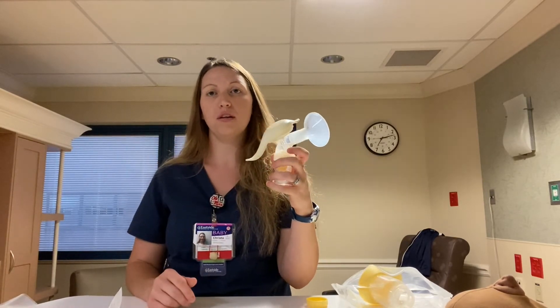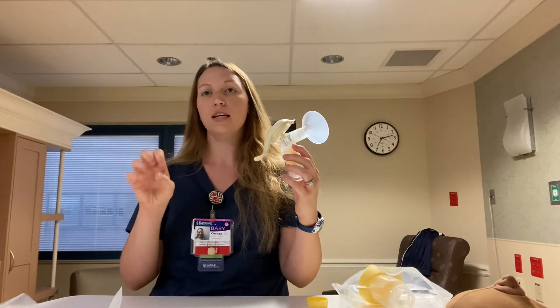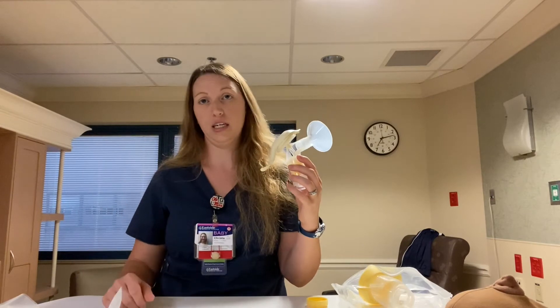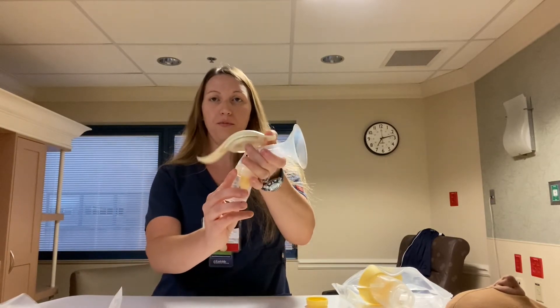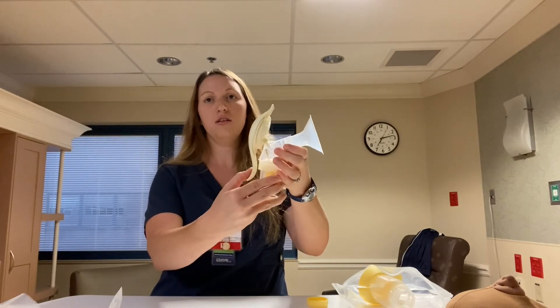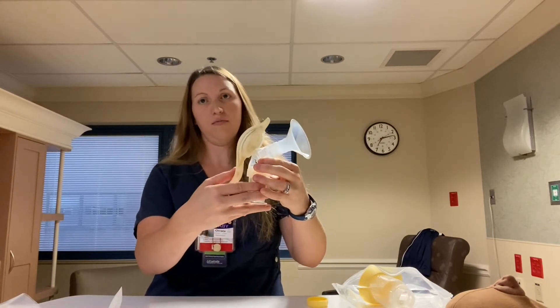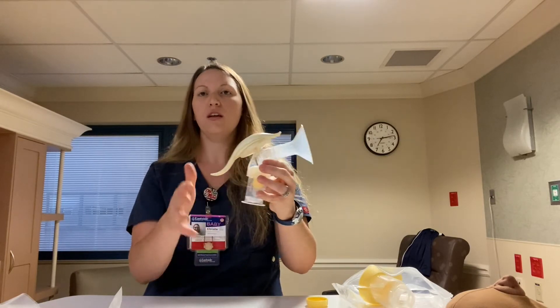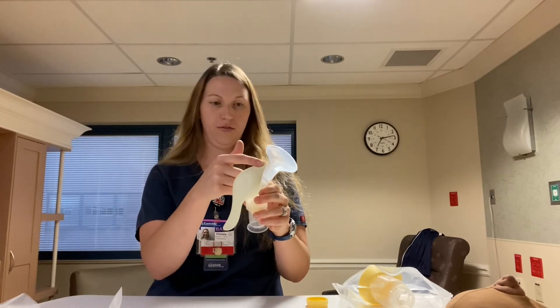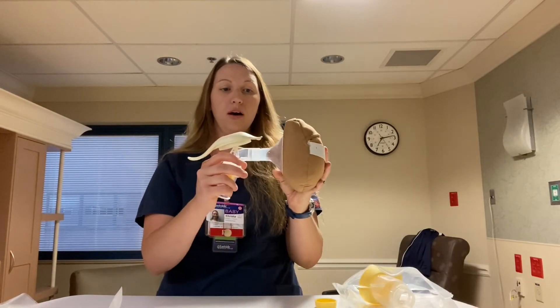Both the hand pump and the electric pump mimic how baby eats at the breast. At first, baby eats really fast until the letdown, and then slows down. Same thing with the hand pump — you can also hear it more audibly with the electric pump. We have the fast side and then the slower side, which mimics those slower sucks from baby. If you forget, all of that is written in the book that comes with the pump, and there's also a little logo on there for the letdown.